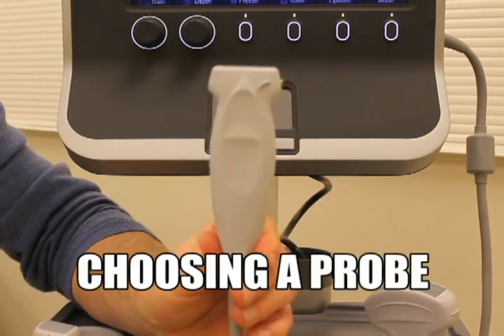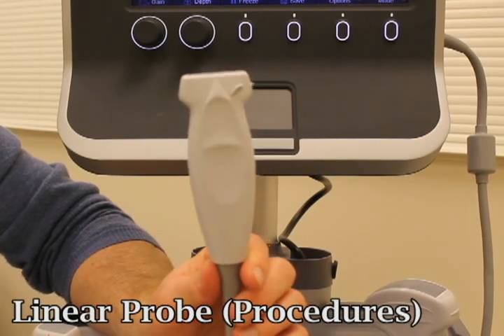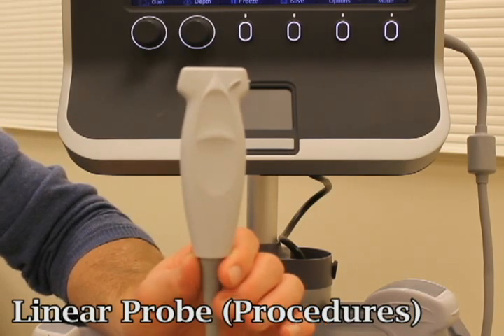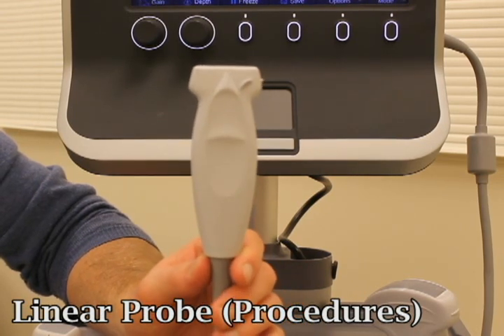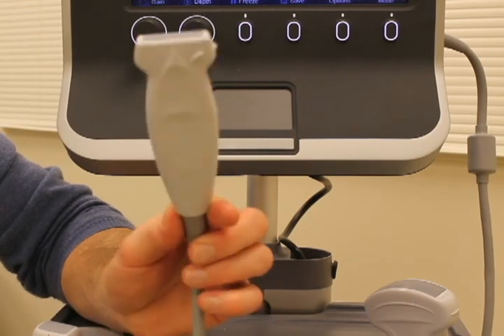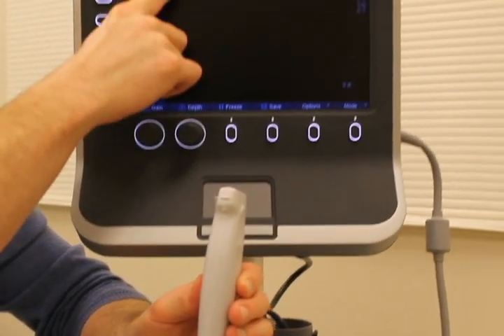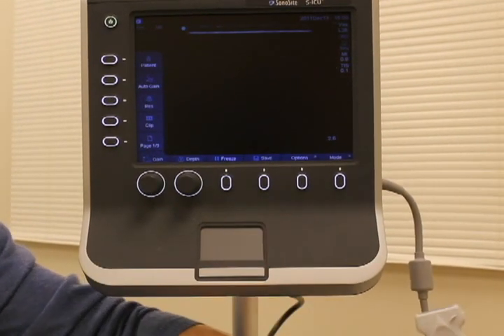The first probe I'm going to show you is the Linear Probe. This is the probe you want to reach for if you're doing procedures. It has high-frequency ultrasound beams which don't give you a lot of depth — you can only go as deep as six centimeters into the body — but it gives you very high resolution to see fine structures. So when you're looking for veins for a central venous line catheter, this is the probe you want to use. It has a probe indicator on the side that corresponds to the dot on the screen, letting you know your orientation.